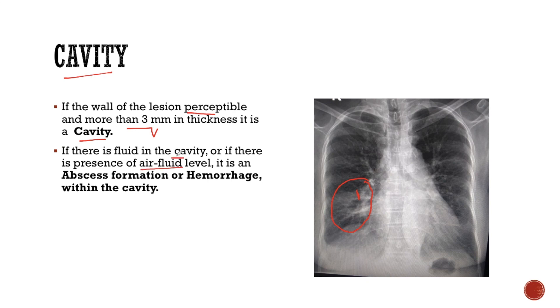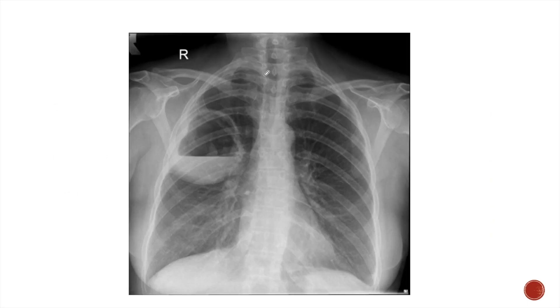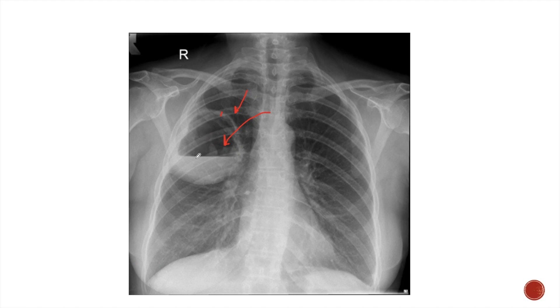If there is presence of fluid in the cavity, or if there is an air-fluid level within the cavity, it is commonly due to abscess formation or from hemorrhages within the cavity. In this X-ray, we can see a lucent lesion in the right middle zone with a perceptible wall measuring more than 3 mm in thickness. This lesion also has an air-fluid level, with the dependent area containing fluid and the non-dependent area containing air. This is a case of lung abscess.